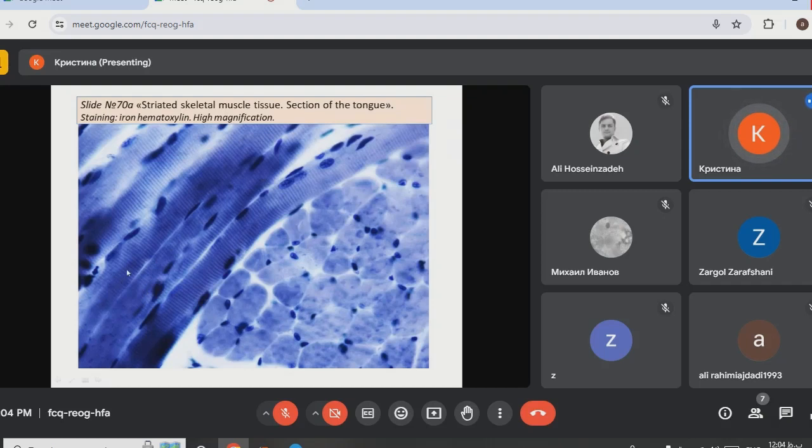These are muscle fibers because you cannot see here the borders between the cells, because muscle fiber is not a cell, it is a multinucleated structure, and cell nuclei are located at its periphery. This can be the nucleus of myosymplast, and this can be the nucleus of myosatellite cell. In this area you can see cross sections of muscle fibers, one here, one here, one here. Also, nuclei are located at their periphery, between muscle fibers, endomysium, between bundles of muscle fibers, perimysium.